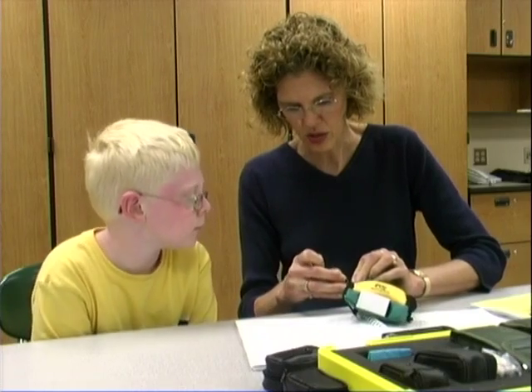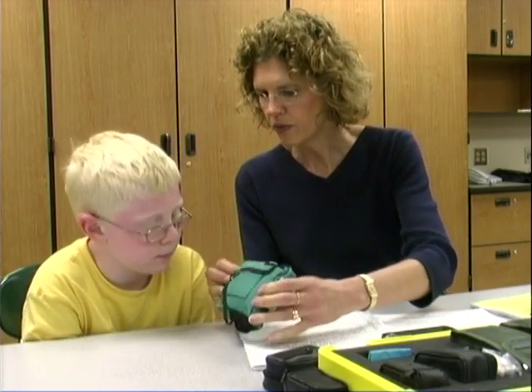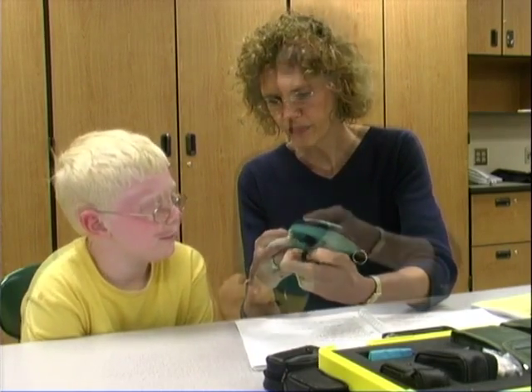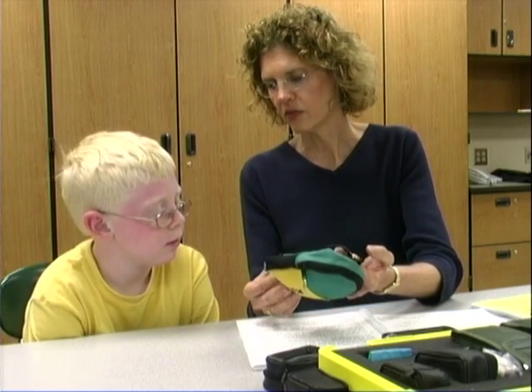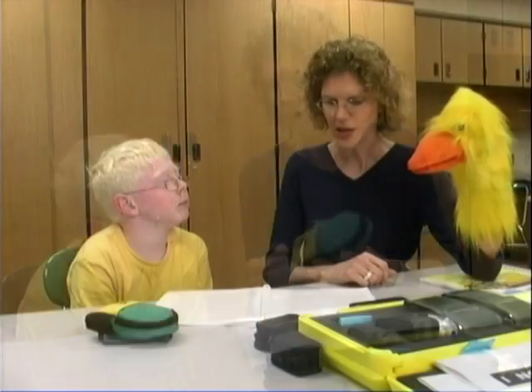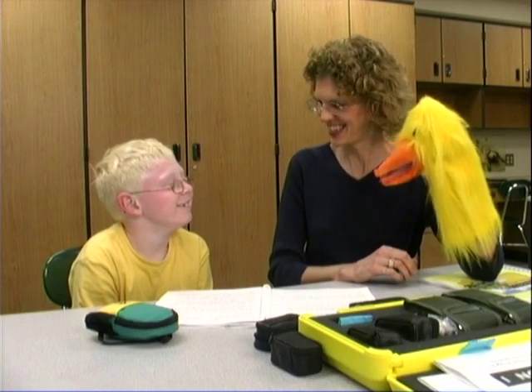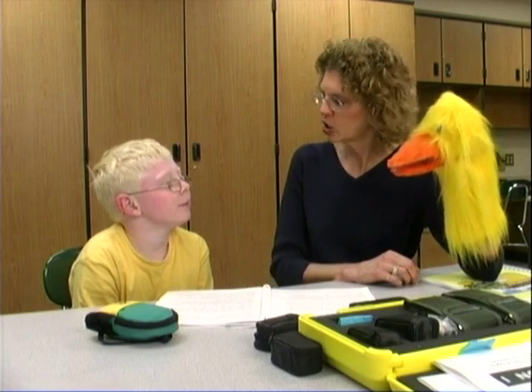You also want your student to care for the monocular properly. Now it won't roll — it's like a mini backpack. There's a strap and it could Velcro to your desk. If your student needs motivation to learn to use his telescopes, there are some really cool stories to stir up his interest, and the name of the story is Emmy Finds a Curious Tube.